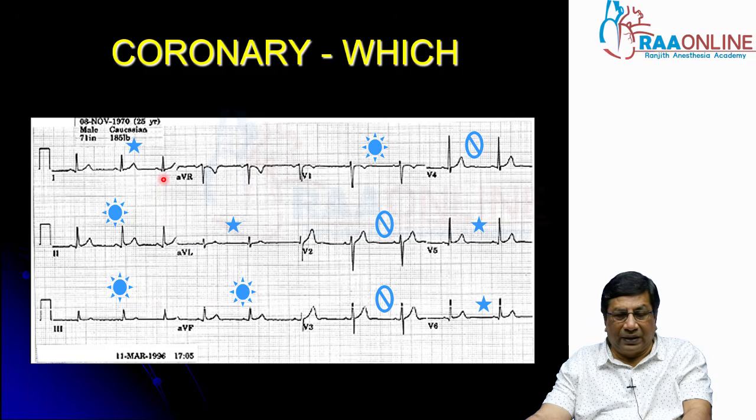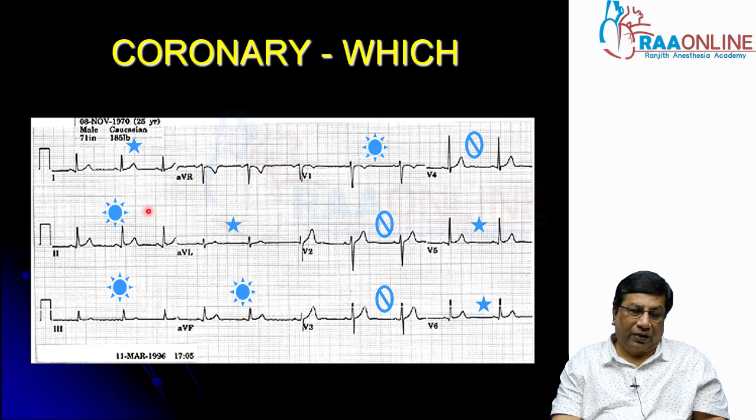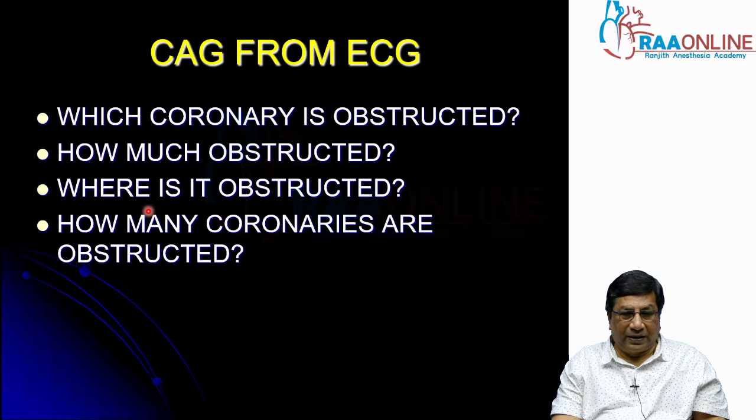Whereas when the patient comes with ST depression or a symmetrical T wave inversion, which represents non-ST elevation ACS, it is most often due to critical occlusion of a major coronary artery, not total, by the white thrombus, which is rich in platelets. That's why you never thrombolyze a patient who comes to you with acute chest pain with ST depression or a symmetrical T wave inversion. So this is the concept of ST elevation MI and non-ST elevation ACS.